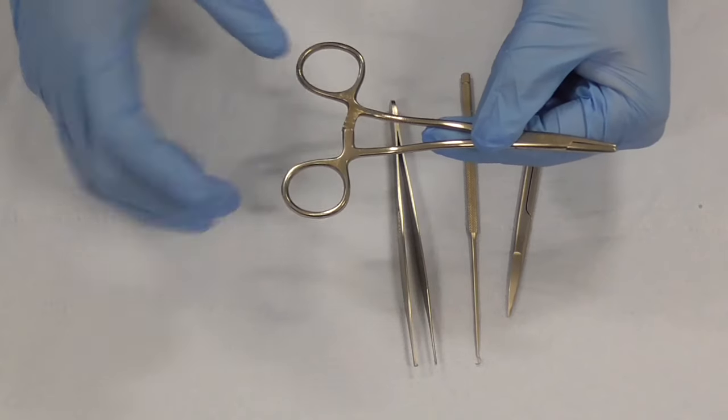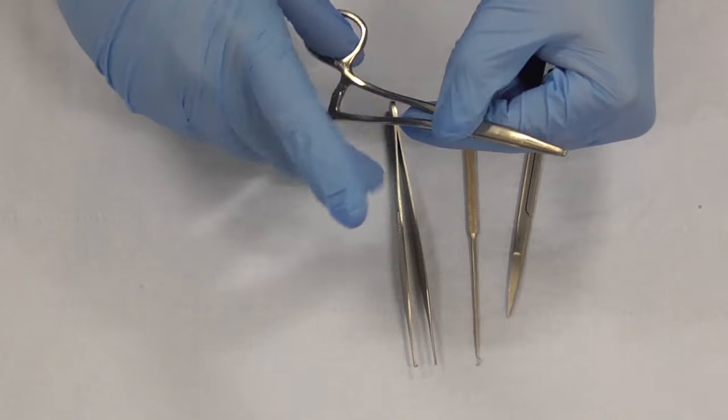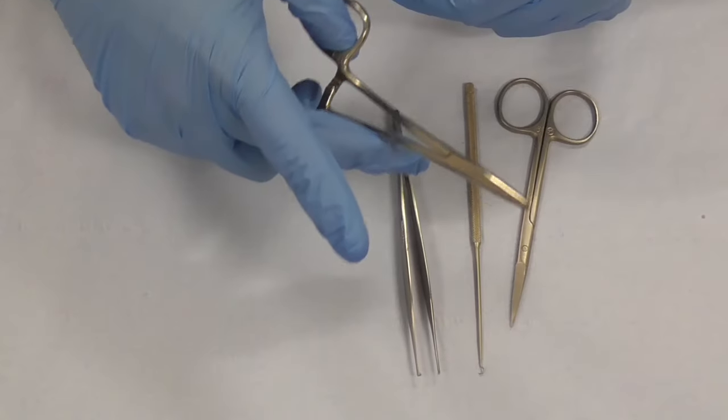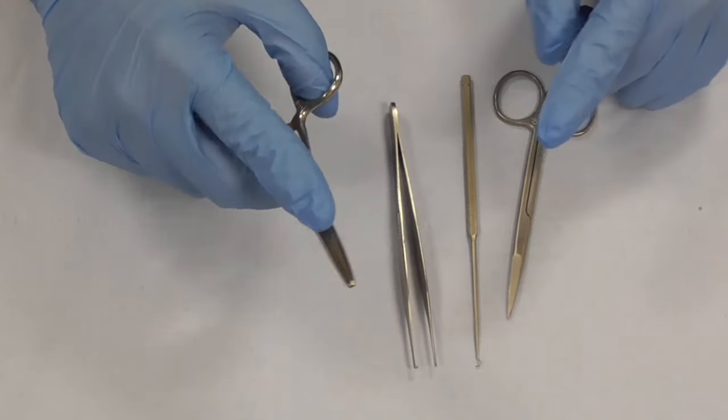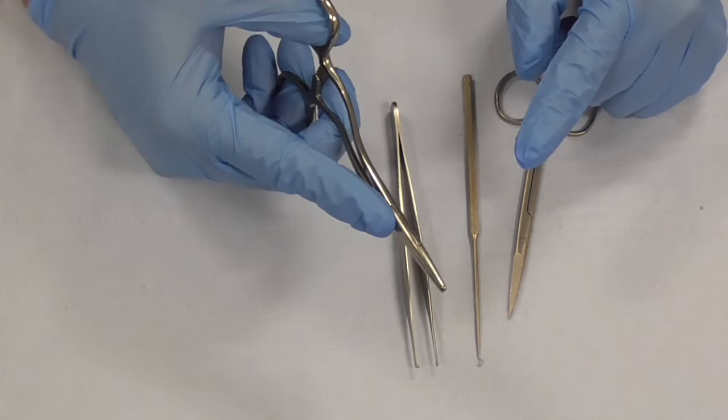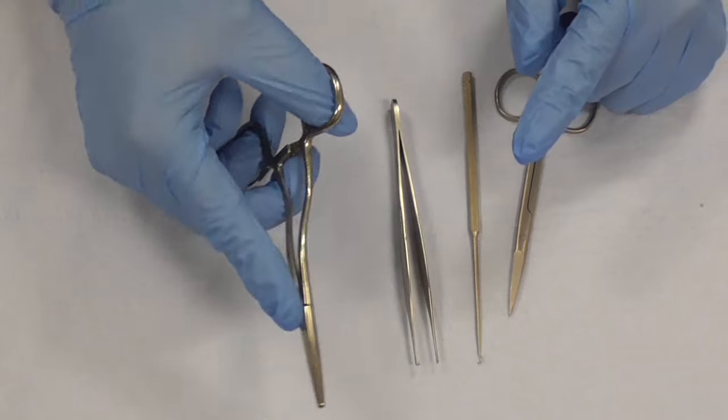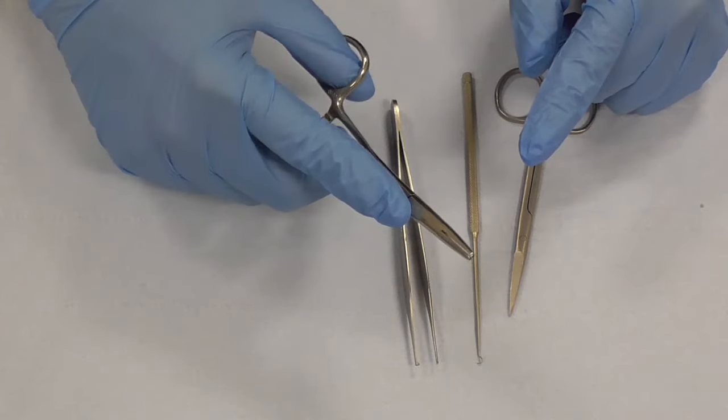So how do you hold it? Thumb and ring finger and then the needle holder rests on your middle finger and the index finger is there to direct it and that gives you the best approach to suturing.